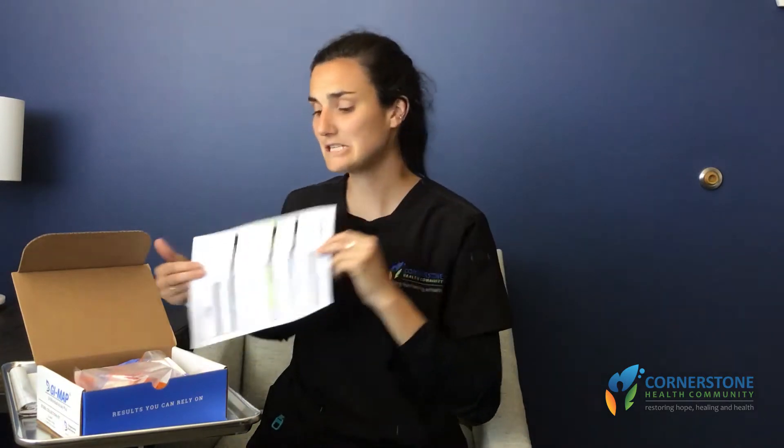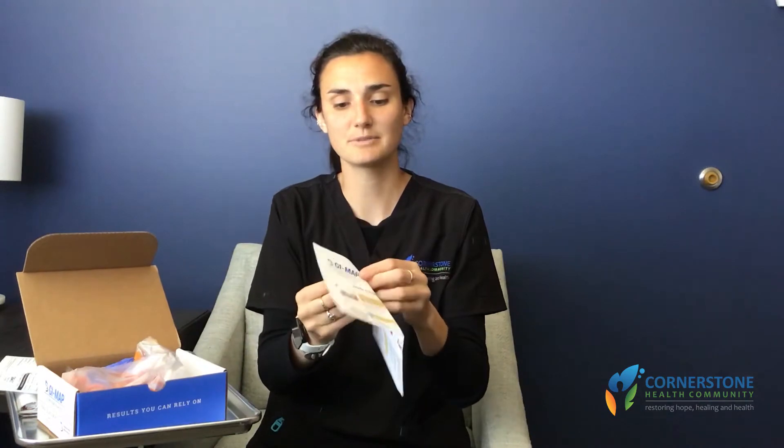Hi there, it's Jules from the lab, and today we're going to go over our GI Maps stool collection. Let's take a look at what's inside. We will have our requisition form, which we'll deal with later, as well as directions from the lab that we will ask you to take a read over.